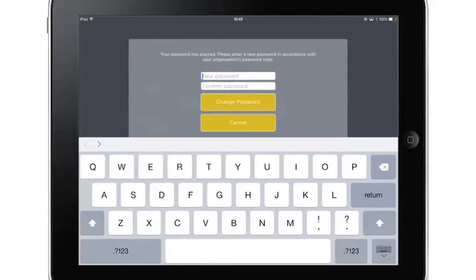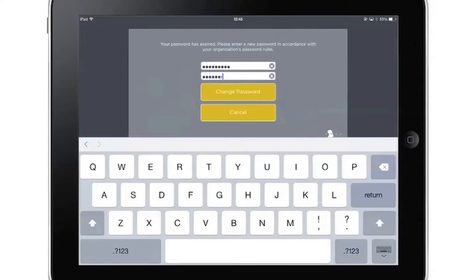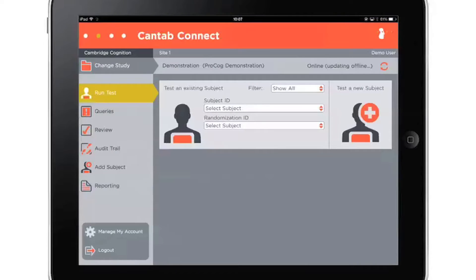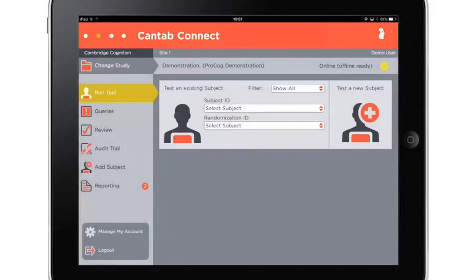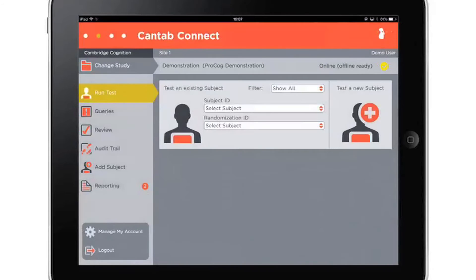When users log in, the system knows the permissions they have on collecting data, whether they are a rater, investigator, or site administrator. When logged in, your organization name will be displayed in this bar, and the user's name will be displayed here. The trial name will be shown here. All information and data is encrypted and stored securely.